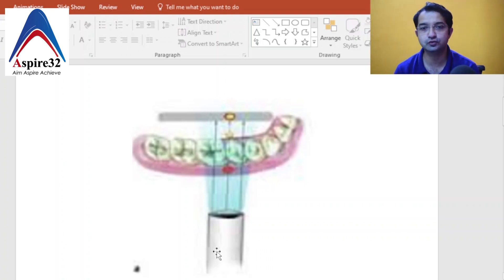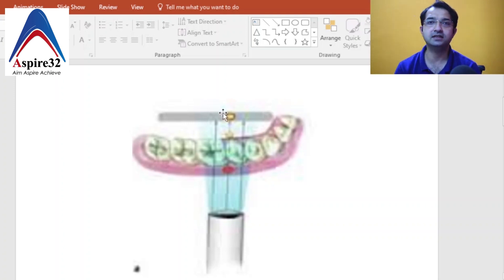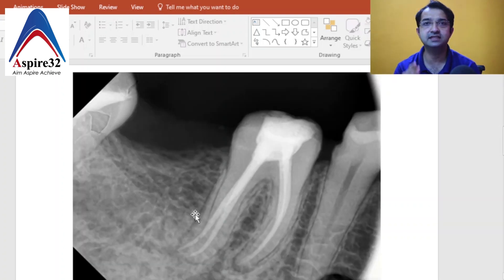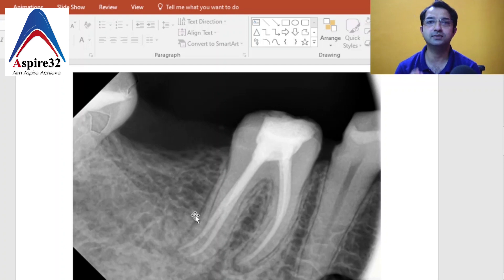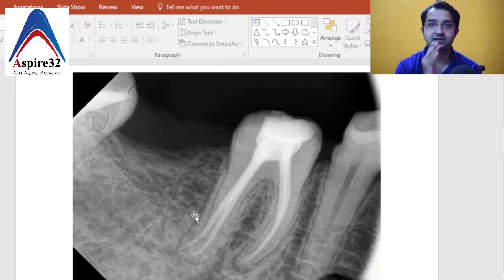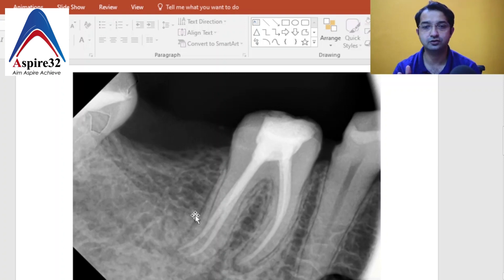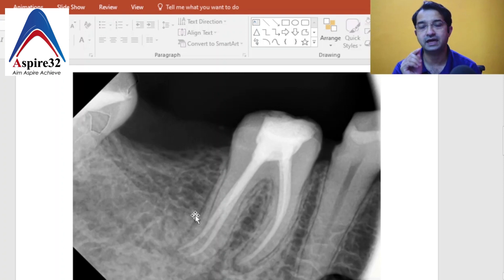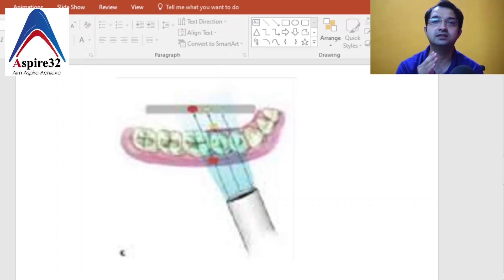Most of the time we take an angulation where the beam is perpendicular to the tooth. As you can see in this image, the X-ray beam is passed perpendicular to the buccal surface, so the mesio-buccal and mesio-lingual canals overlap if they are in the same line. In this case, the distal canals appear separate, but the confusion is in the mesial root. To separate them we give a 20 to 30 degree angulation to the X-ray beam.